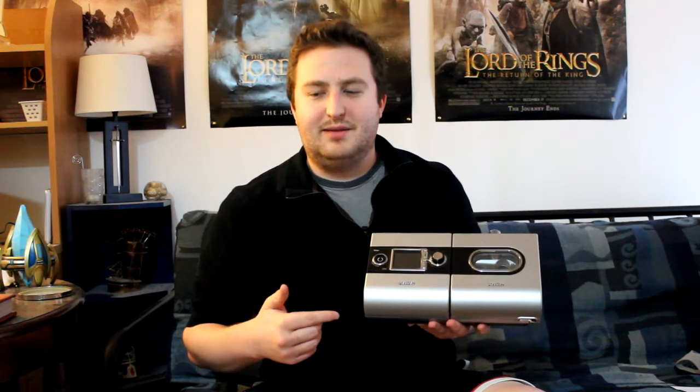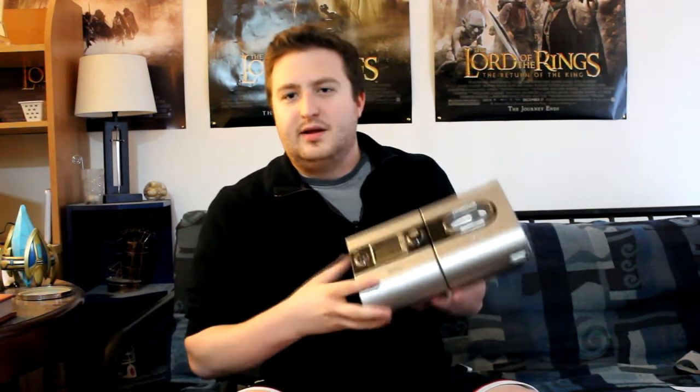This is a CPAP machine. CPAP stands for continuous positive airway pressure, meaning it applies pressure to keep the throat open at night.